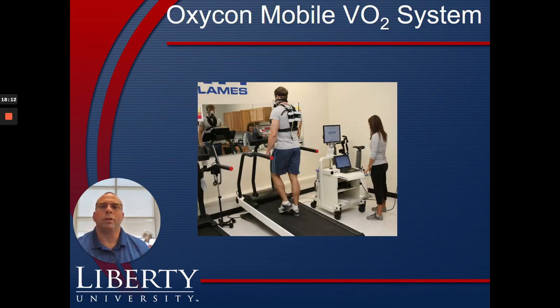This is one of our two types of VO2 systems we have in the lab. It's an Oxycon Mobile VO2 system. And with this system, the person actually wears most of the electronics associated with this. They're wearing the electronics, they're wearing the headgear. There's a home base here that it's sending the information back to. And so the nice thing about this system is we can test them on different apparatuses or in different environments than we normally could because they're not tethered to the computer. We could have them running outside, running upstairs, wearing this system, and we continue to get the information sent back to the home base.